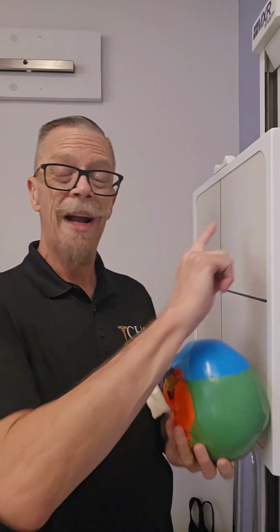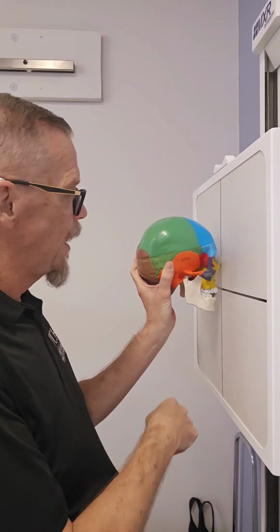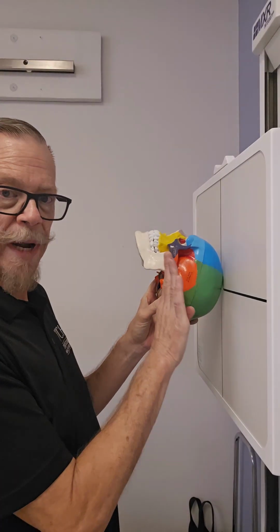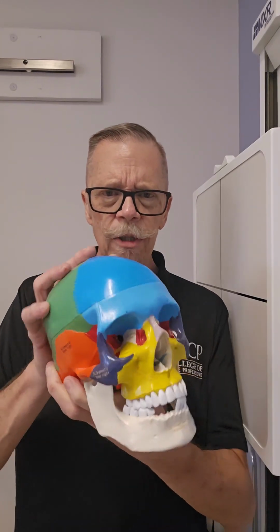Also remember, we have one projection called the SMV where we have to have the IOML parallel to the IR. We already talked about it being perpendicular, right? But now if it's parallel, we have to have the patient looking up with this line right here parallel to the IR. So learning the difference between how things look perpendicular and parallel, from the anterior and from the lateral view, we've got to get those lines perpendicular or parallel, however they're supposed to be, to the IR.